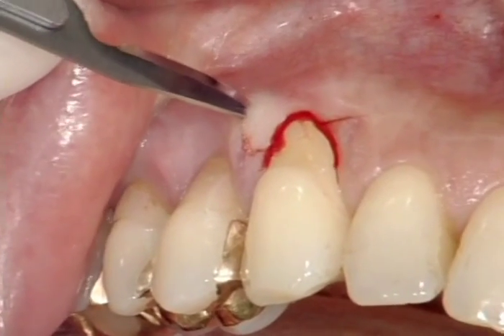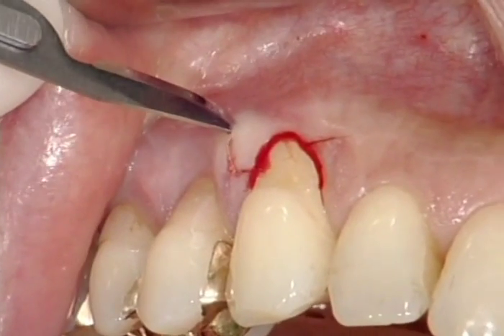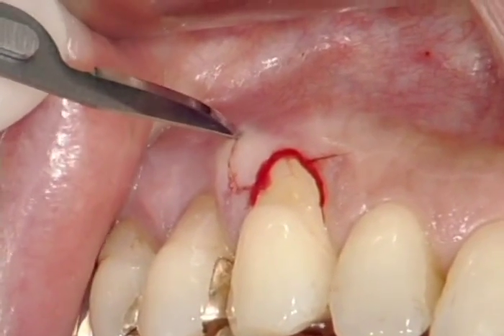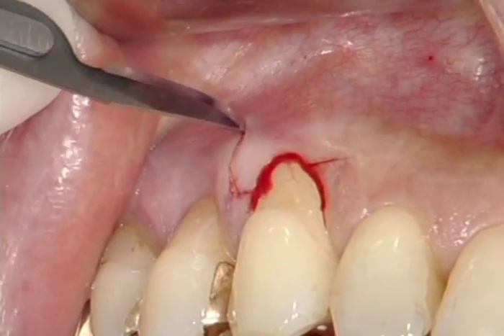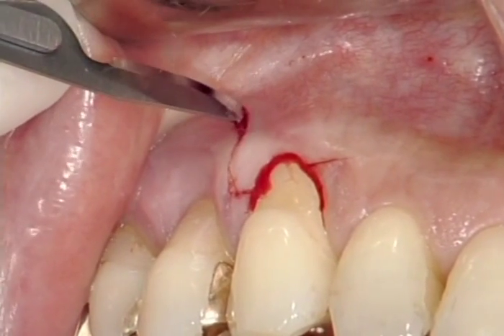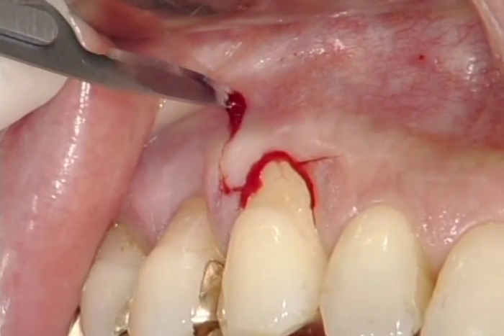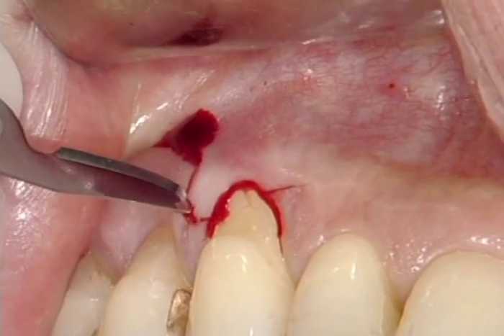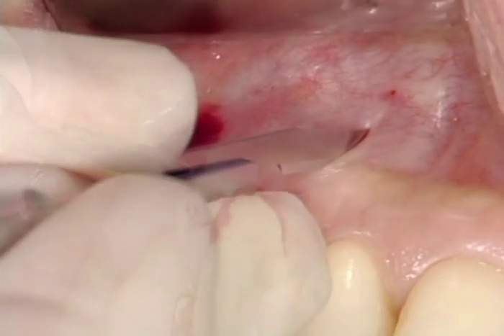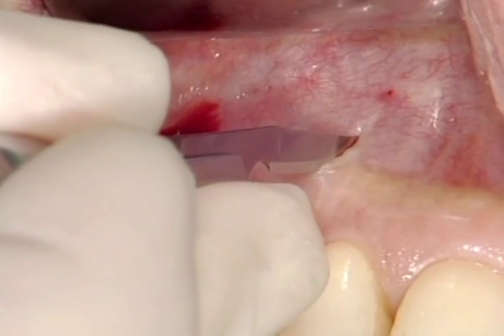Two vertically divergent releasing incisions are made, starting at the lateral end points of the horizontal incisions. They run apically across the mucogingival junction.